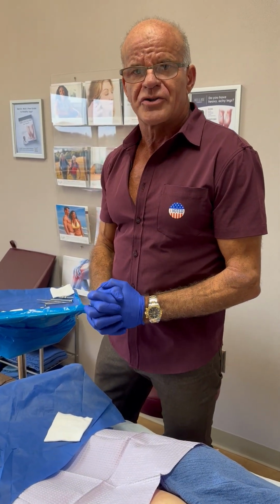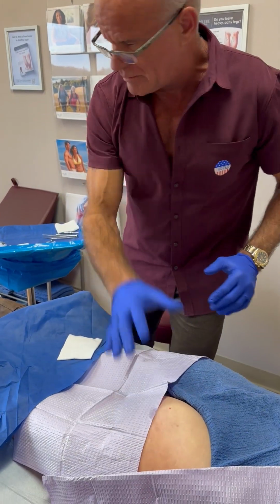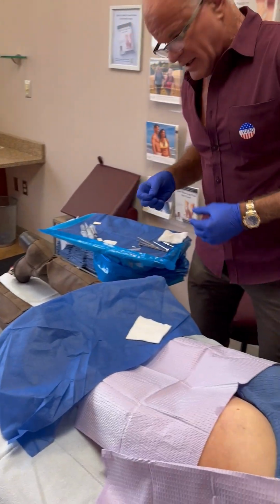I'm Dr. Charles Moak. I'm going to show you a pellet insertion into a woman. You can see she's laying on her stomach, and this is her right butt cheek. You should look at her boots down here at this end. You get her context. So I've already pre-numbed her.